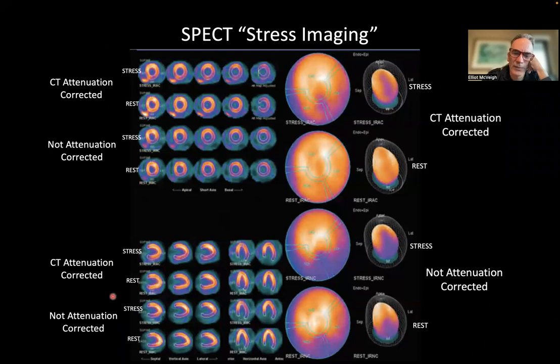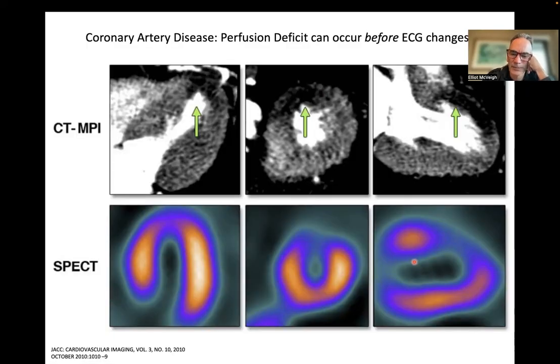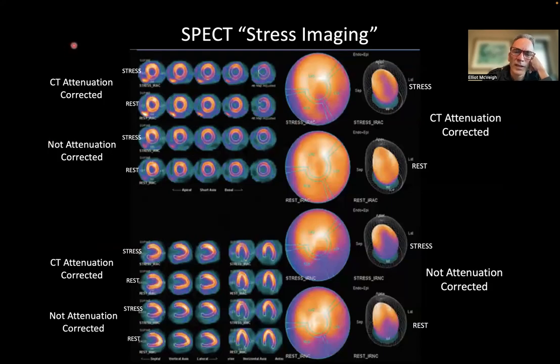So let's take a look. I mean, this is the thing that we've been looking at. And we can start looking at some case studies now as to what's going on here. We briefly looked at this slide on Monday, showing the importance of doing attenuation correction for each patient. It turns out that there's two factors, obviously, that create a brightness in these pictures. One is how much agent is at that location, and the other is how difficult it is for a photon to get out of the patient from this location, right?